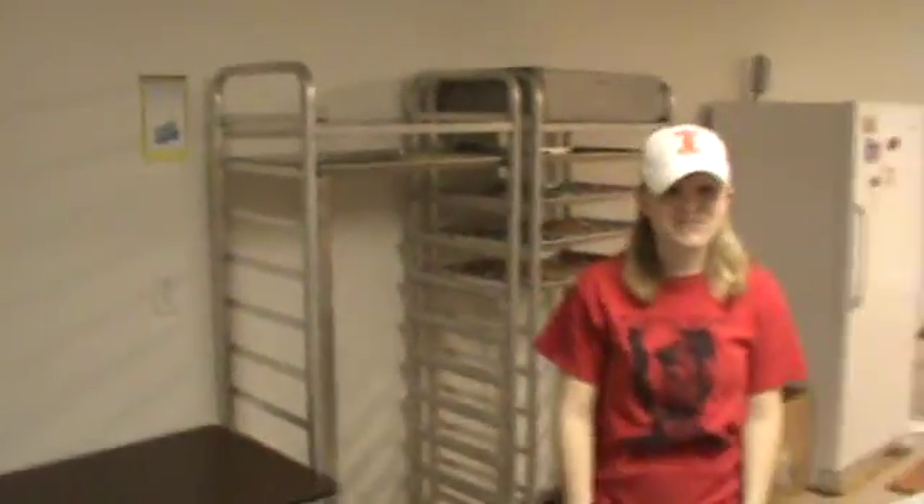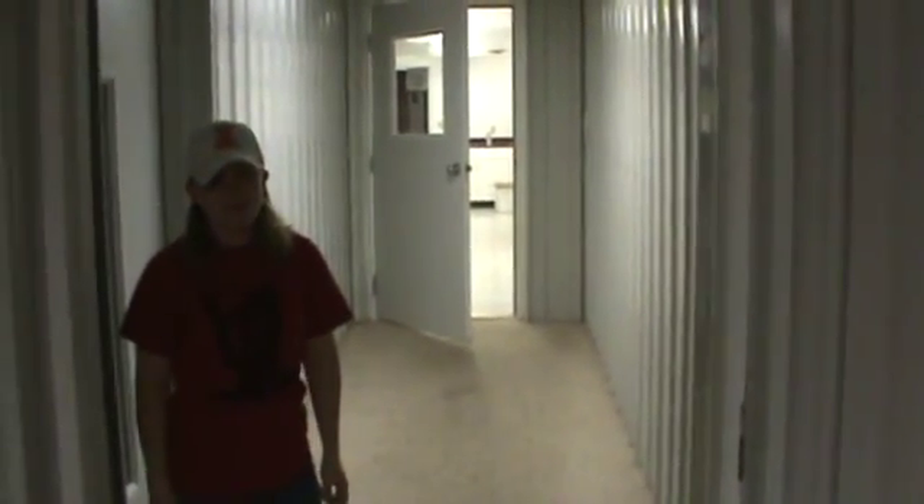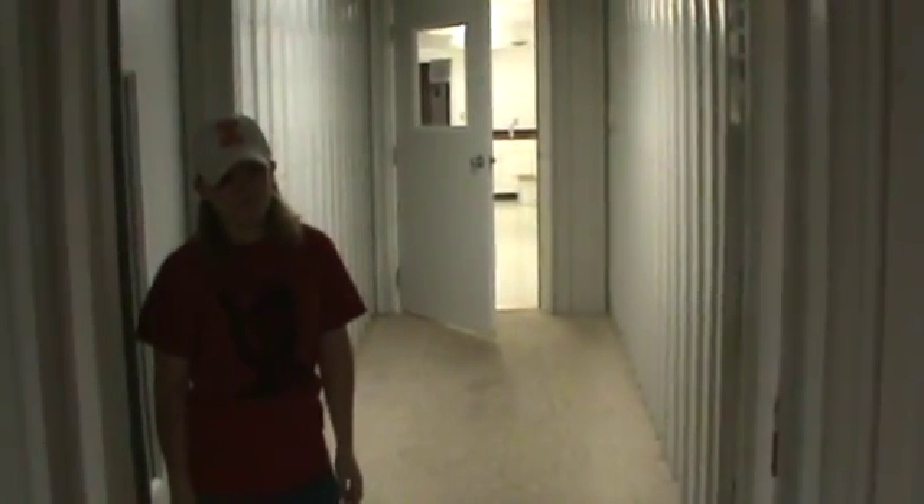So folks, you just saw a tour on how we process semen here at Prairie State. That's one boar down, and on a busy day, just think about doing 89 more of those and trying to get that done in a five or six hour period. Thanks, Marissa, for your help. And if you ever have any questions about semen quality here at Prairie State, feel free to give us a call. Thank you.